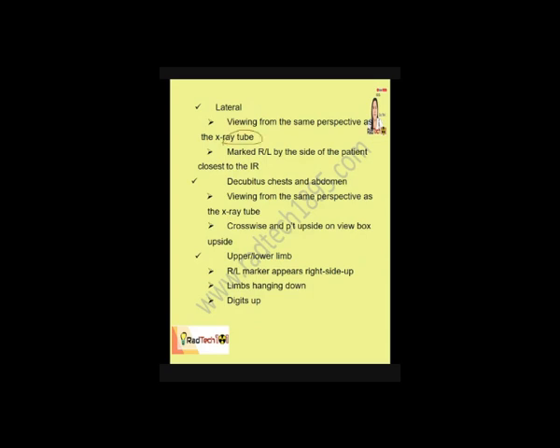So, halimbawa kanina, sa either AP, PA, or oblique, so, halimbawa, ito yung ating negatoscope. So, we will put our radiograph here as if we are facing the patient.